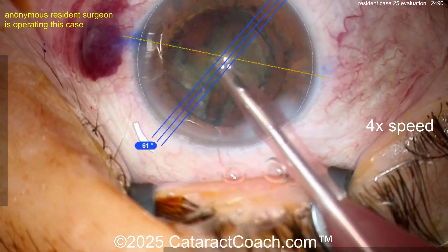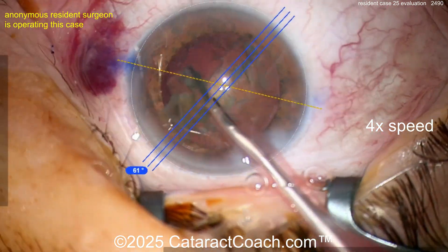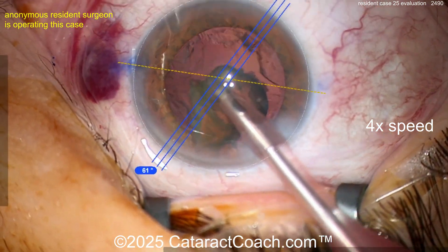You need to put in a little more effort on the important things — in this case, keeping the eye more in primary. Don't have the eye dance around so much. And keep your other hand in the eye. You have two hands — why not use two hands at all times?